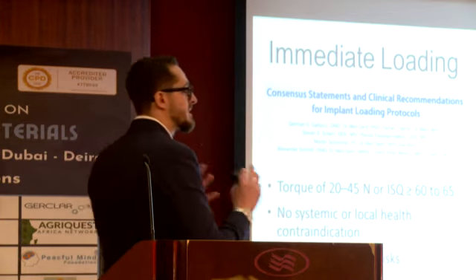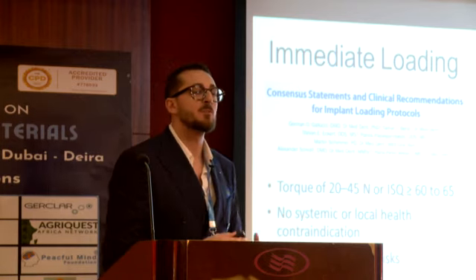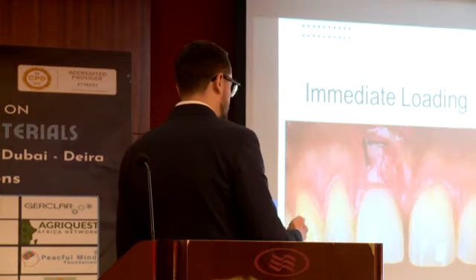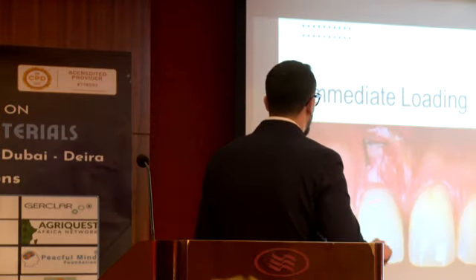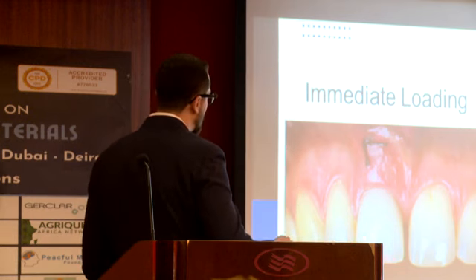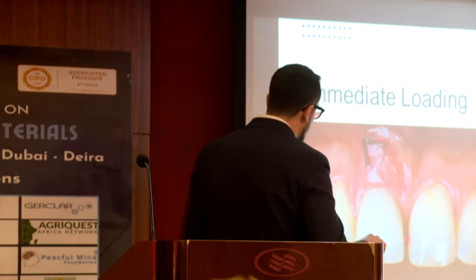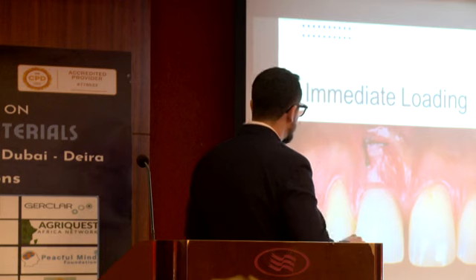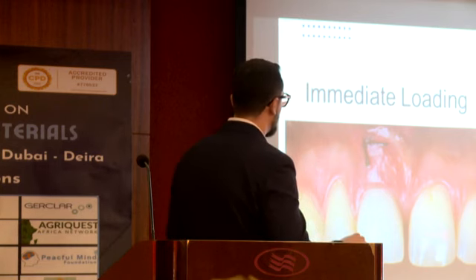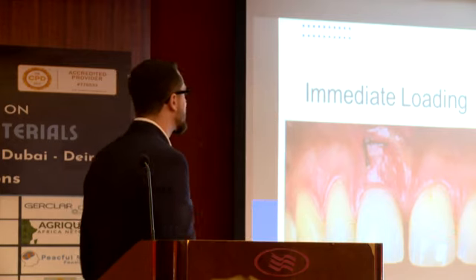And since we have stable soft tissue from day 0 of the surgery, we'll also have hard tissue stability from day 0. So we are taking the impression, and just a few hours after the surgery, we are having a good provisional restoration that should be shorter than the contralateral in order to avoid any occlusal contact. In this case, we have a little diastema. I explain why. Because in the mesodistal aspect, the veneer that she had was bigger than the contralateral. And I also offered the patient to receive a veneer in order to do the final restoration.